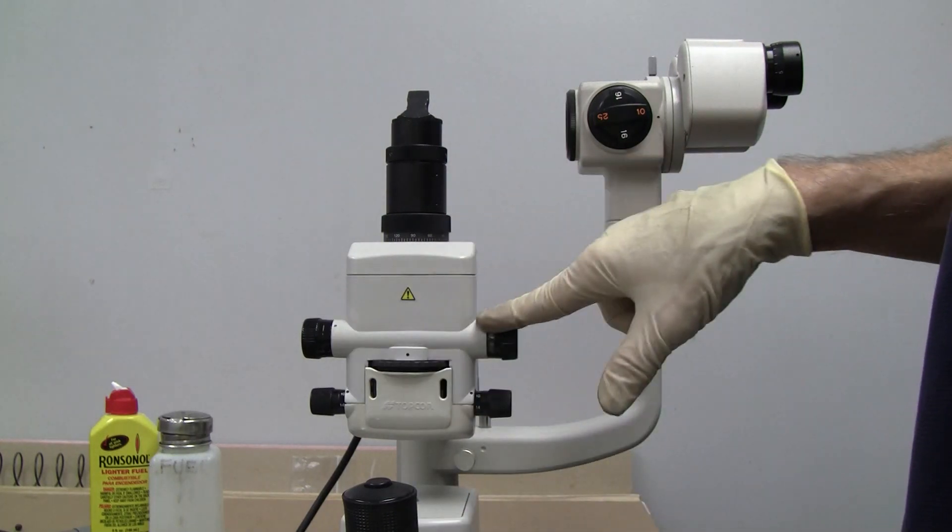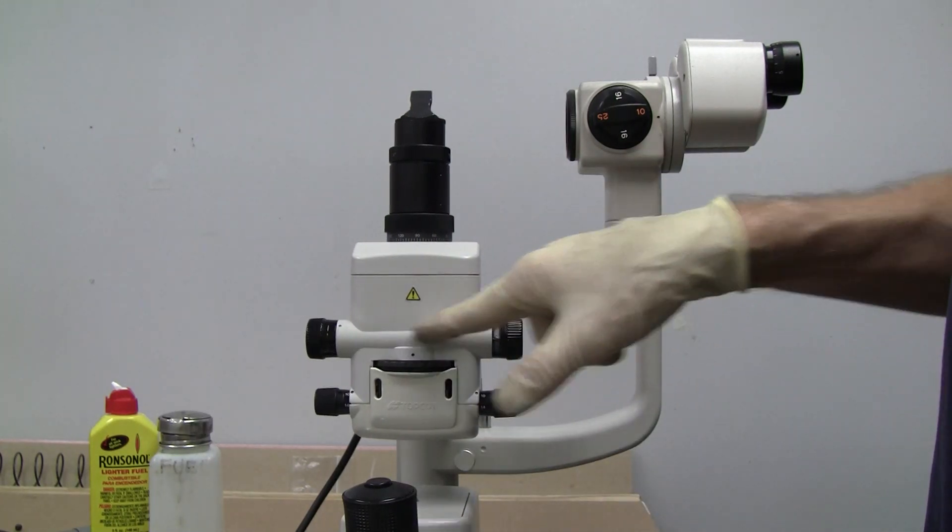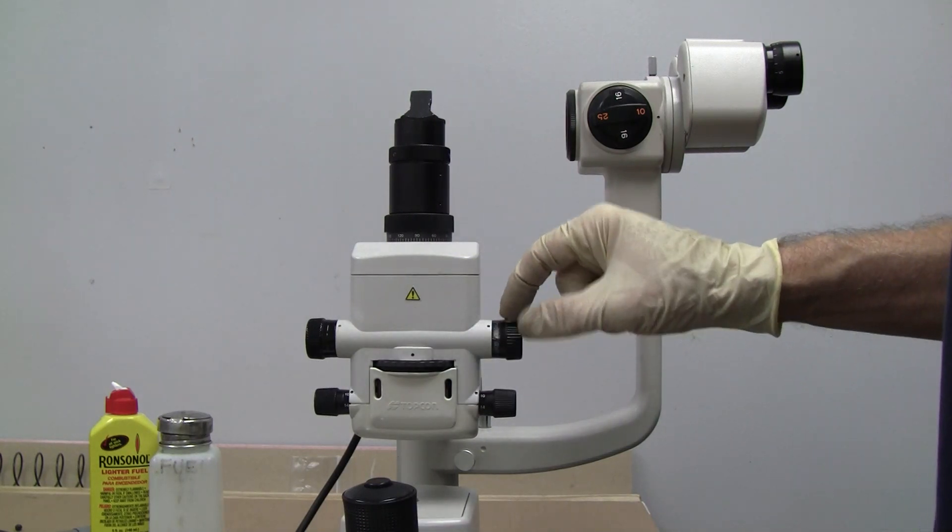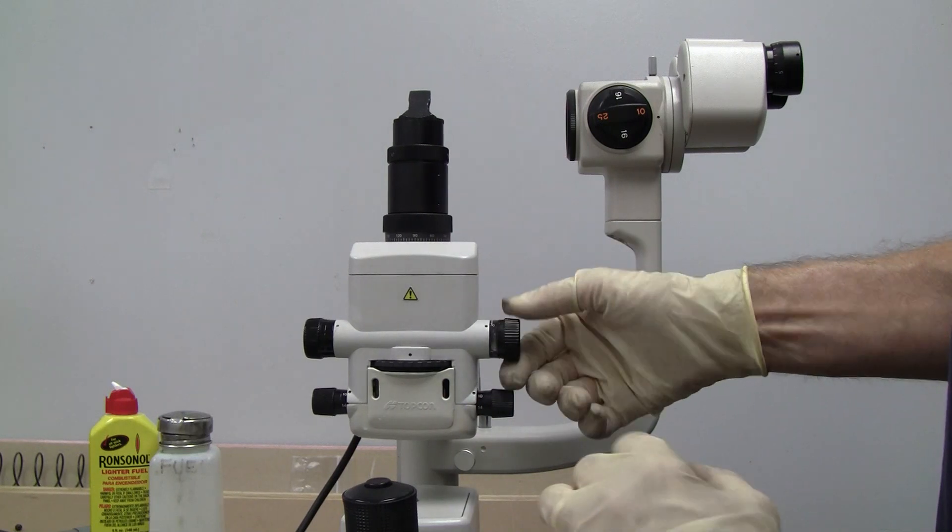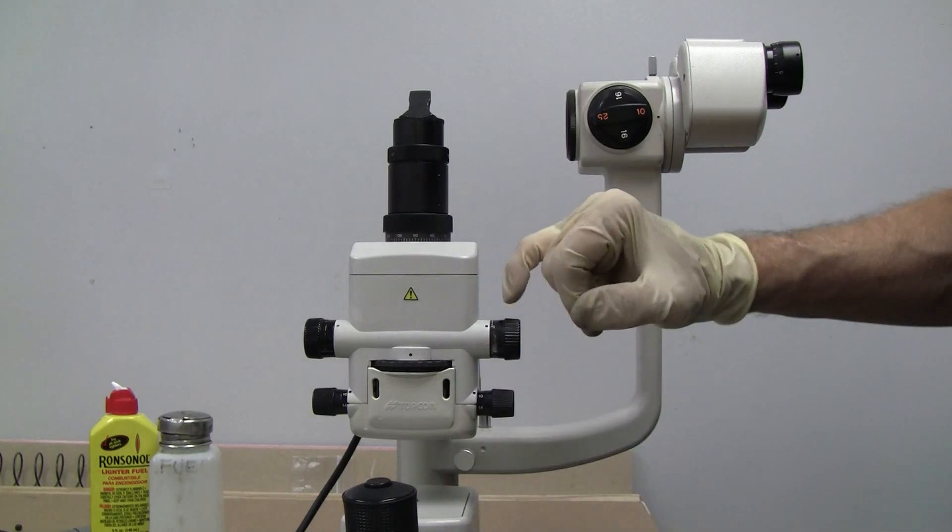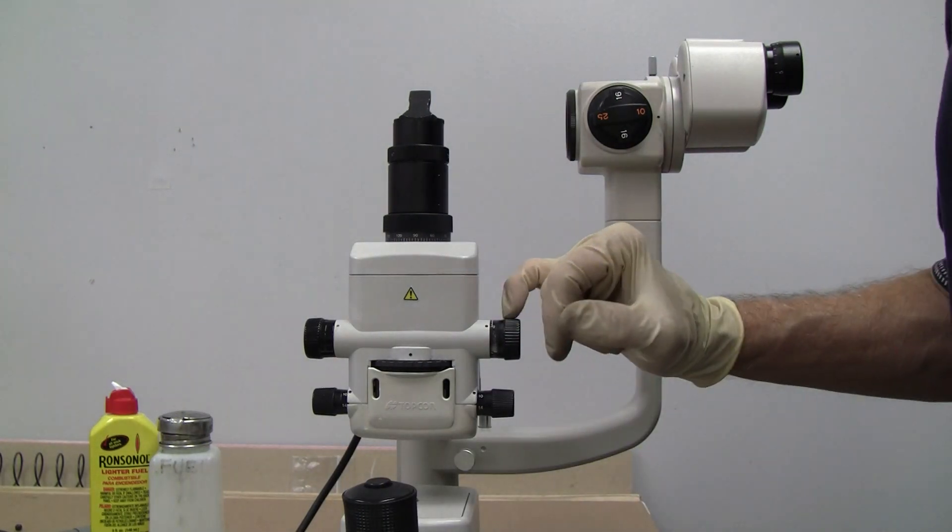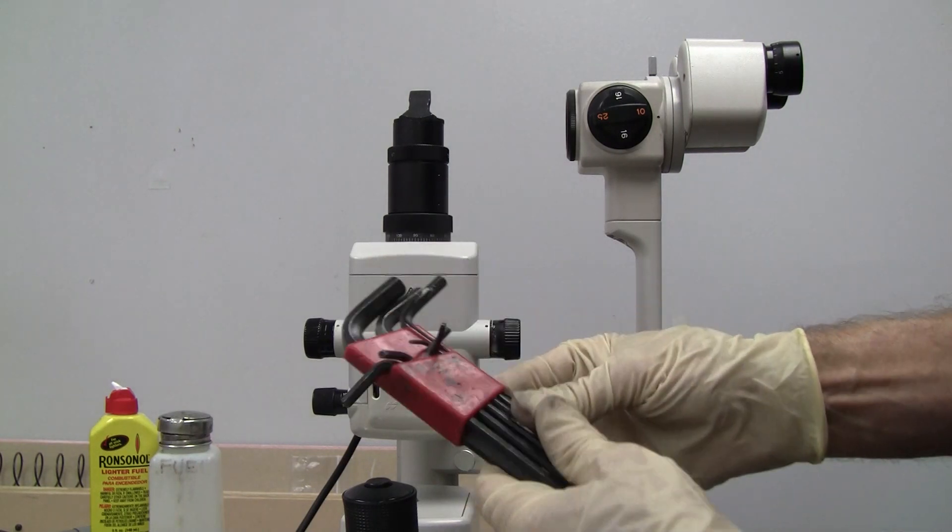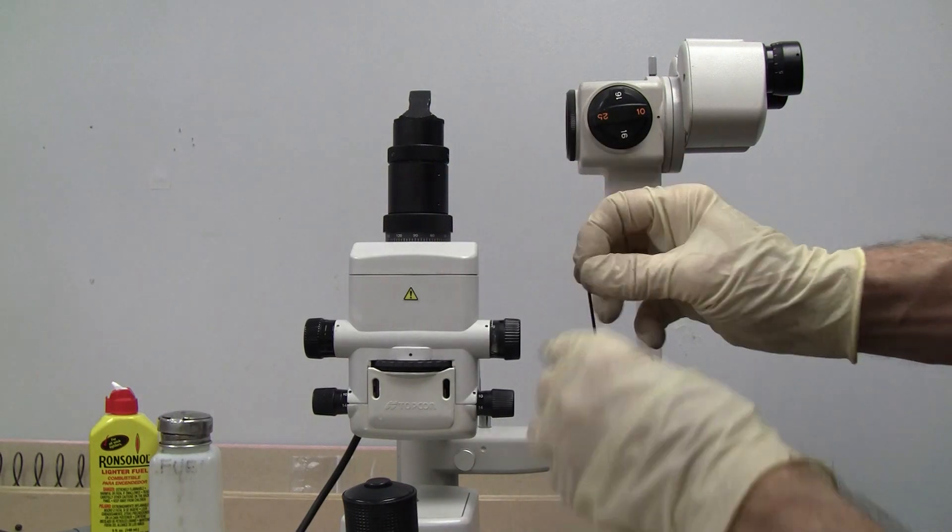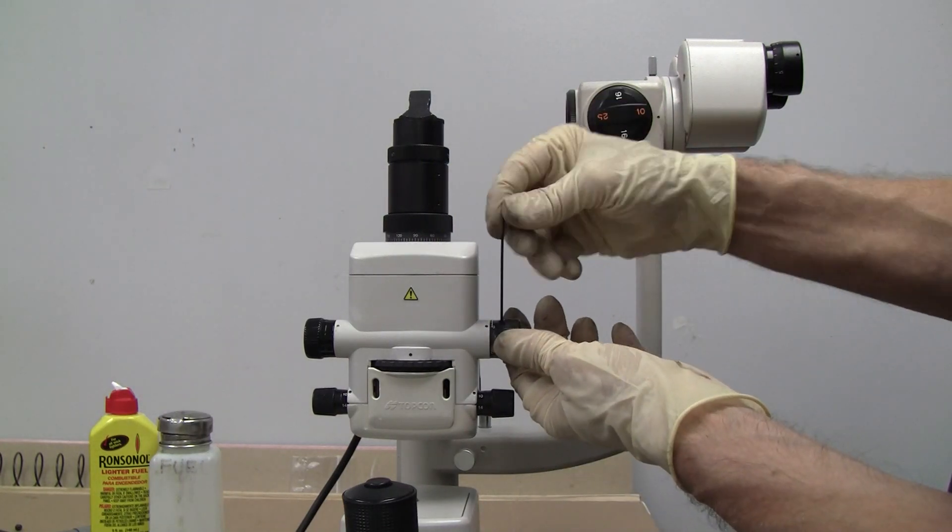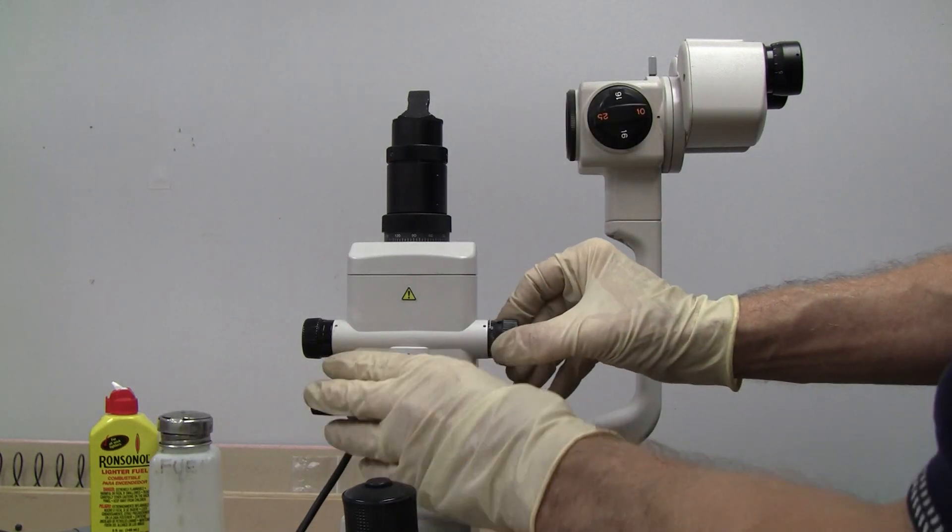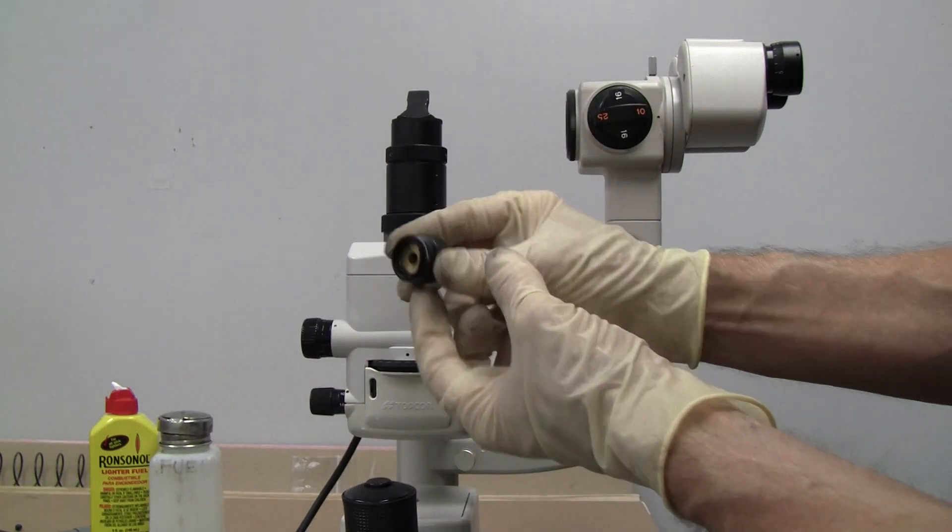And we're going to address it by cleaning this whole axle and putting new grease on it. So the way we do that is I'm going to take this knob off here with our smallest Allen. It's a 1.5. I'm taking it off.